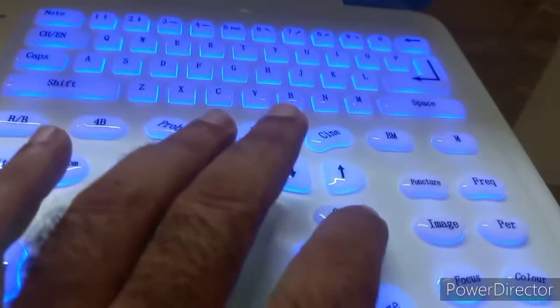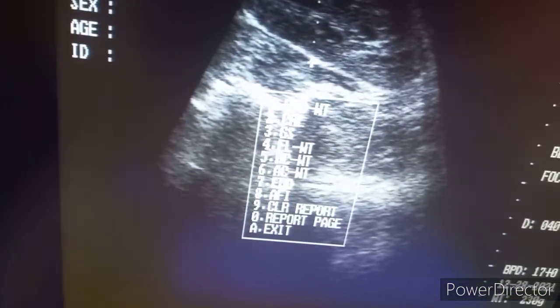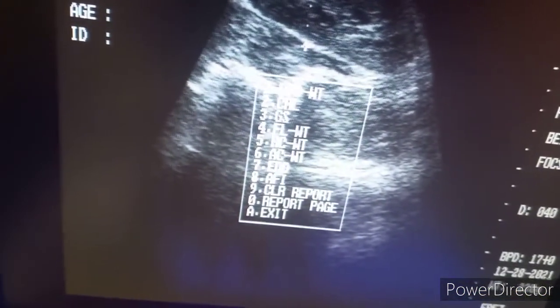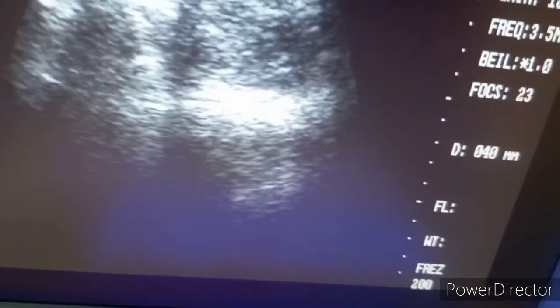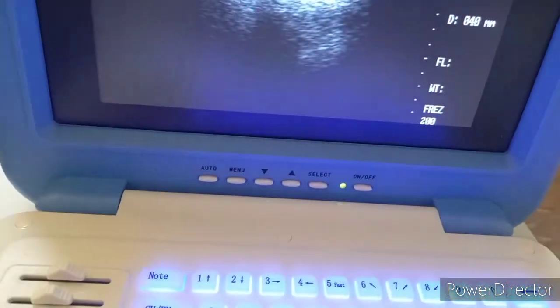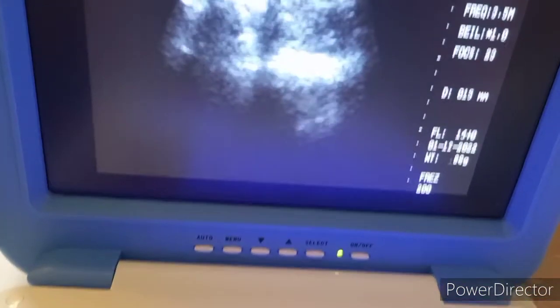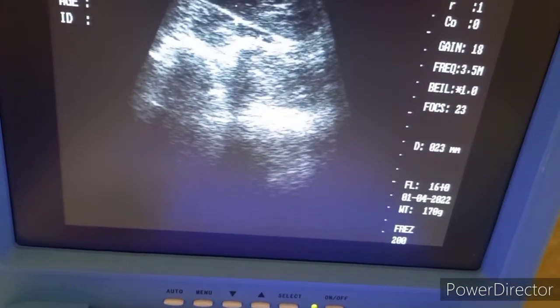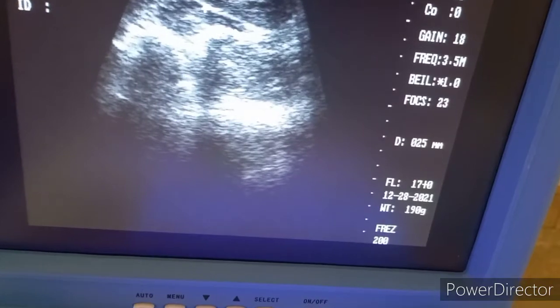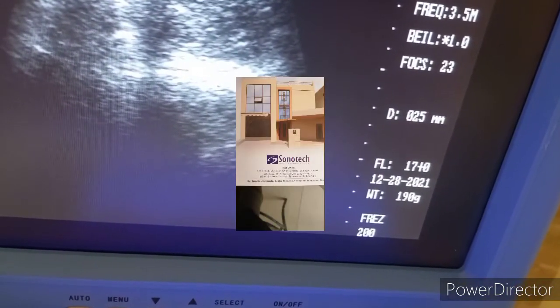For femur length, press obstetric. Select number 4 key for femur length, press left to start, and right to end. We will get the femur length measurements.